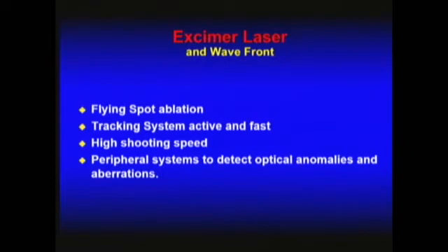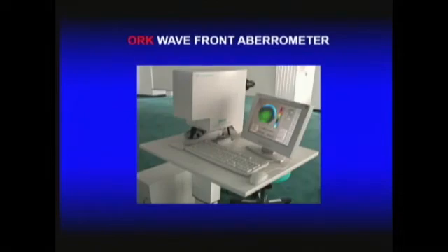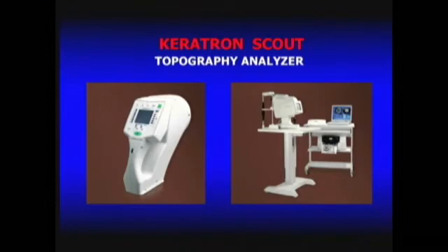For the excimer laser and wavefront, we need flying spot ablation, an advanced and active fast tracking system, high shooting speed, and peripheral systems to detect optical anomalies and aberrations, which are the wavefront aberrometers, and also a very advanced and sophisticated topographer analysis.